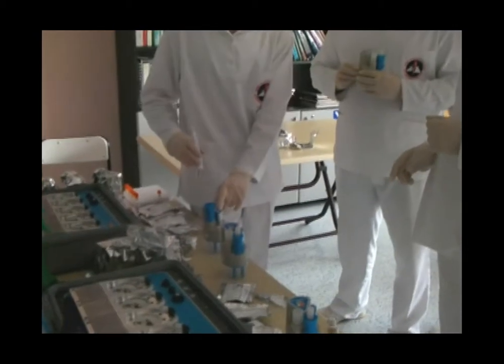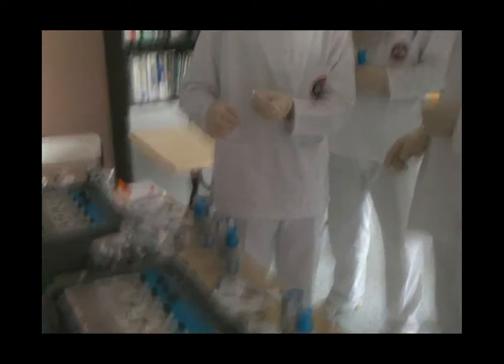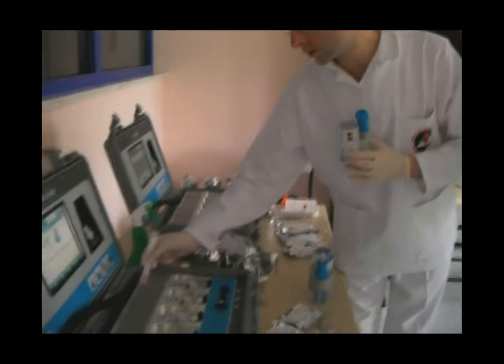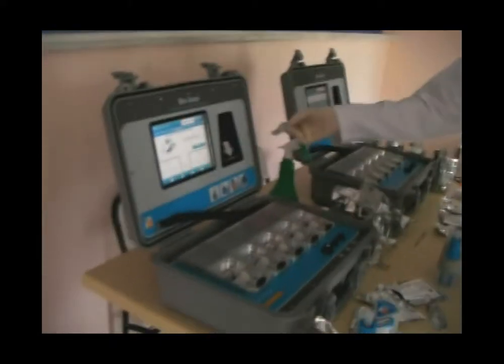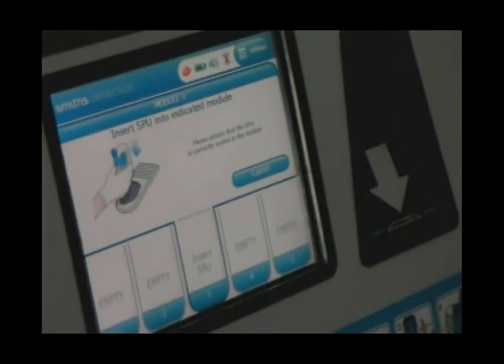We won't use this barcode here — it's old. We've got these new ones. We have two: barcode one, which is for the sample preparation, and when that's finished we run barcode two. I'm going to scan our barcode. It's easier if you hold it quite low rather than up high.